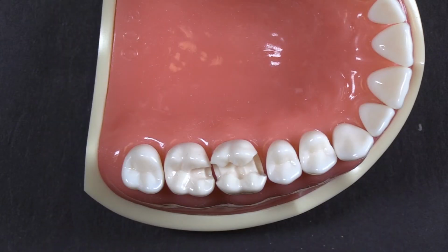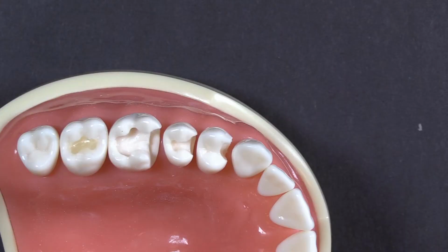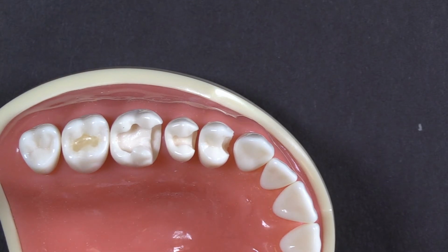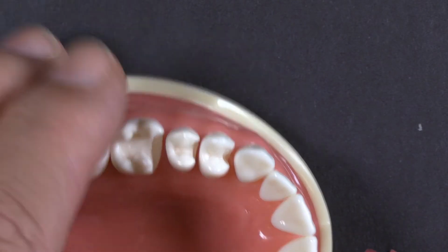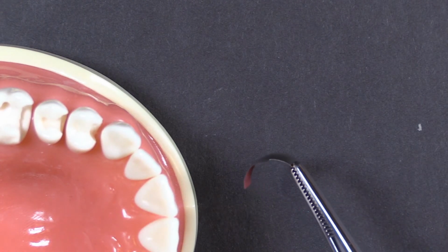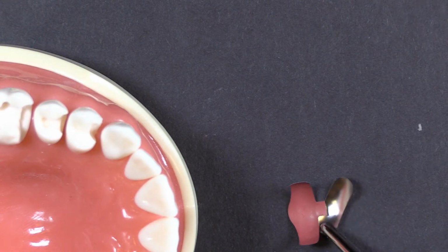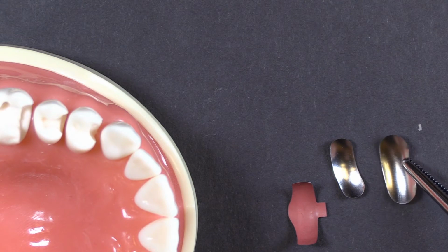This kind of leads us right into another question about MODs and multiple band restoration. So in this scenario, when the tooth is not a full-size adult molar, with some of the newer bands that we have, they wrap around the tooth quite a long ways. They are quite a bit longer than, say, these are the original bands from back in 1996. Here's the molar version of that band.